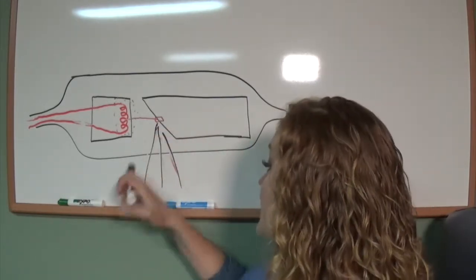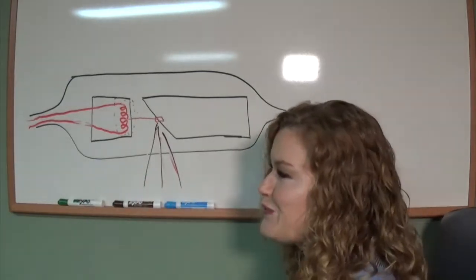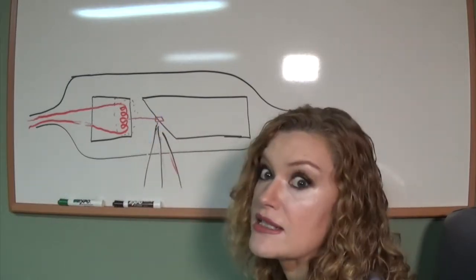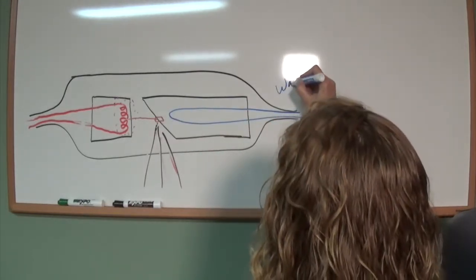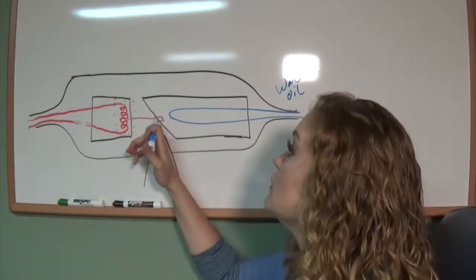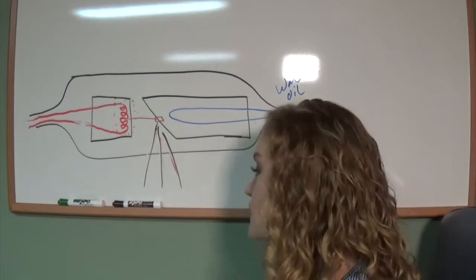Now, making these electrons is a pretty heated situation. The anode target can reach over 1000 degrees Celsius. It can get so hot. So we do have cooling units, and the cooling unit can be water or oil, just like in your car, to help cool down this target. That is the whole purpose of the cooling system.